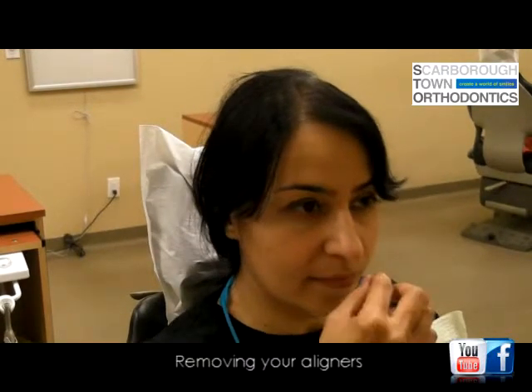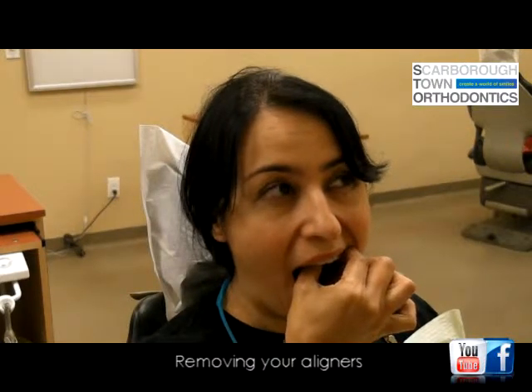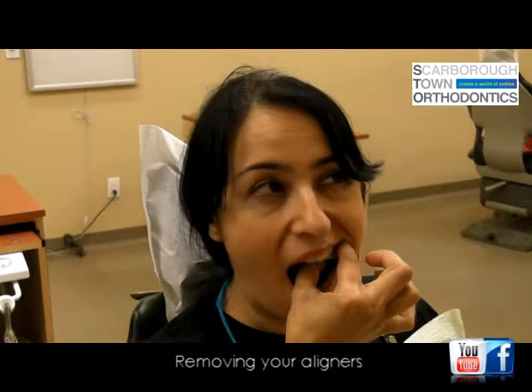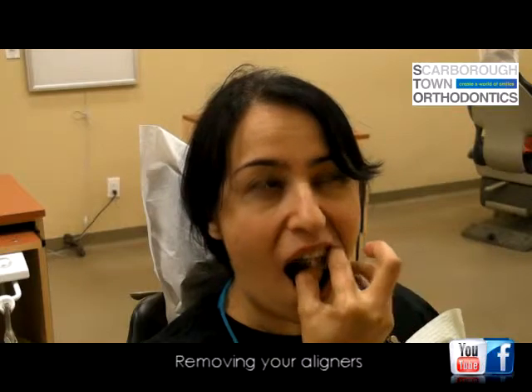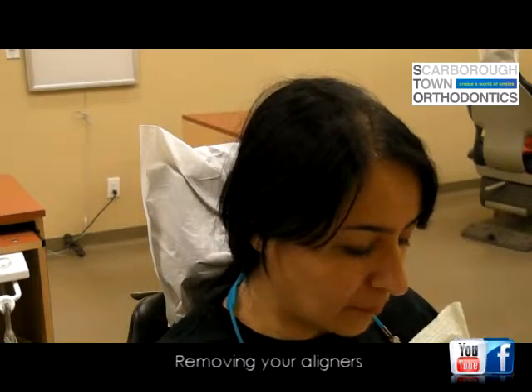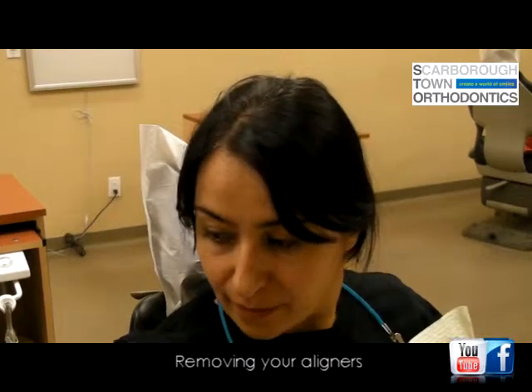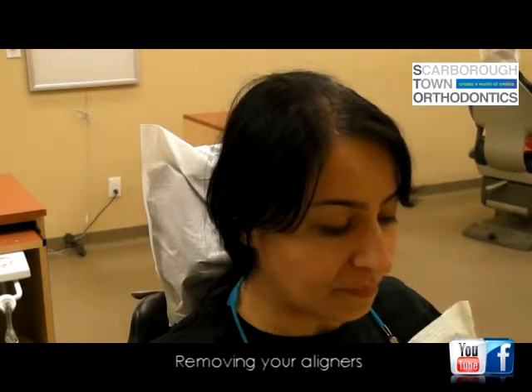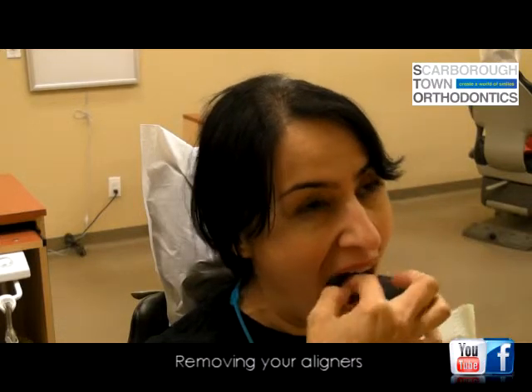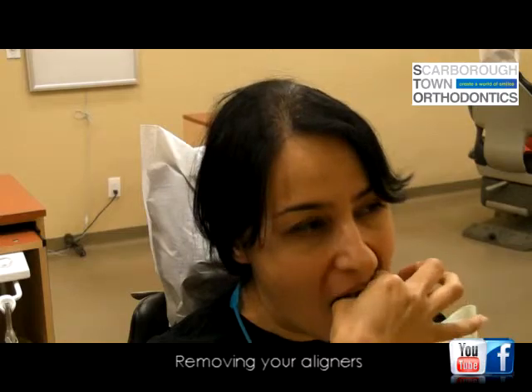When you're removing the aligners, you're going to use your fingers and remove from the inside part of the aligner. So with your right hand, you're going to go to the upper left side and grab at the very back. Once you get one end loose, you can pull the entire aligner out. Same for the bottom. Whichever side you want to start with is up to you. You're always going to use the opposite hand to get to the opposite side of your mouth.